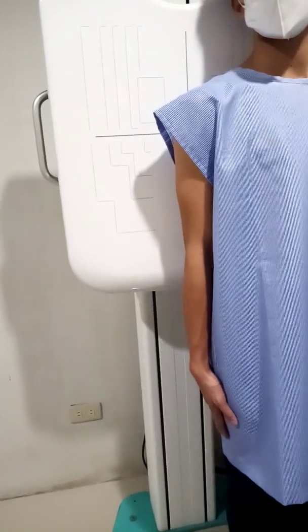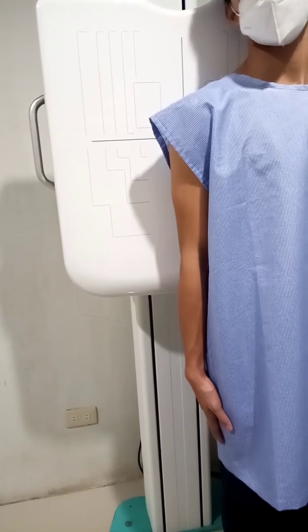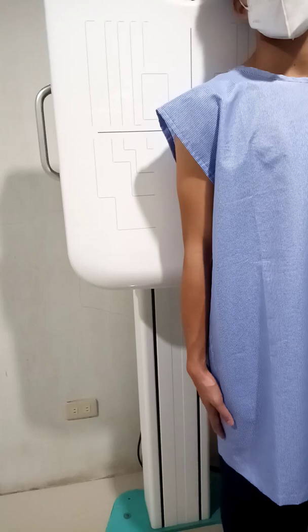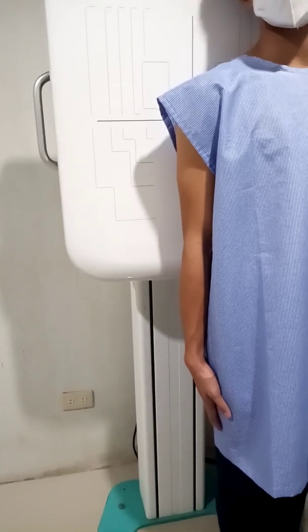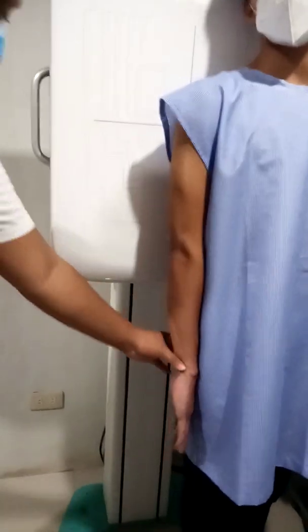So if you want to rotate the humerus in internal rotation, ask the patient to flex the elbow, somewhat rotate the arm internally, and rest the back of the hand on the hip. Very good.